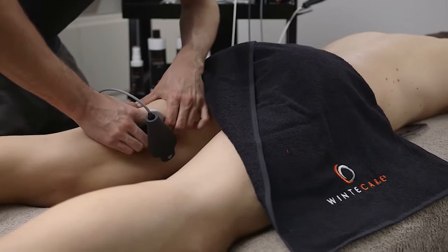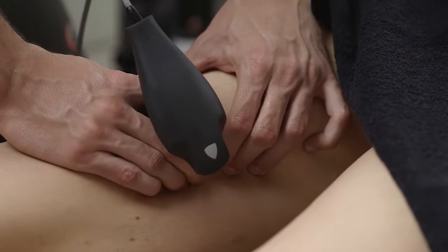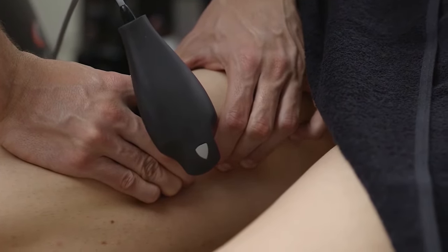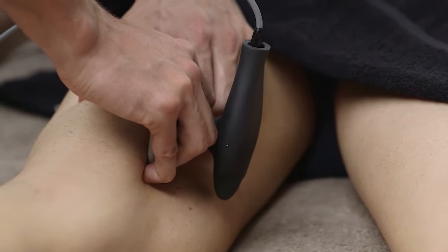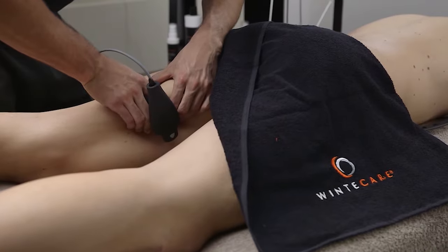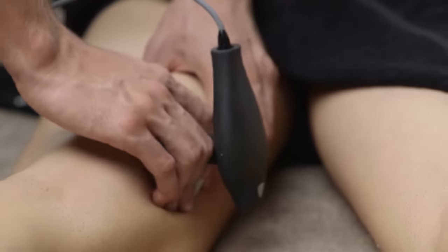Its special coatings, metals and shapes, used for the various types of electrodes, make T Plus the only tool in its category worldwide capable of being applied even without the use of conductive cream.